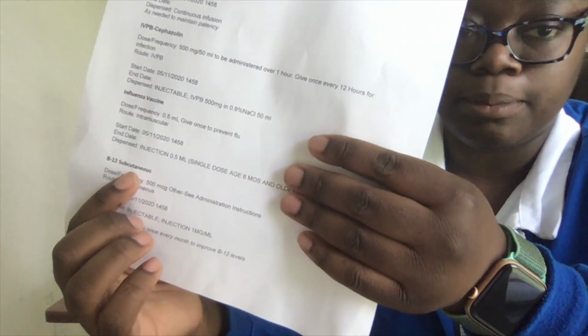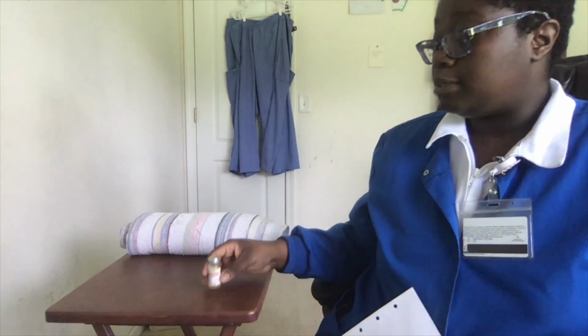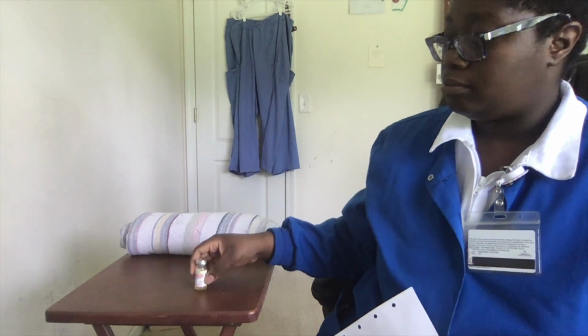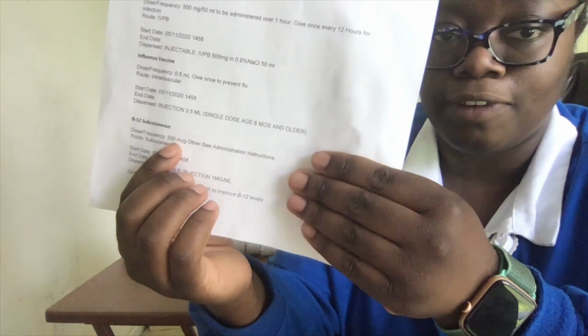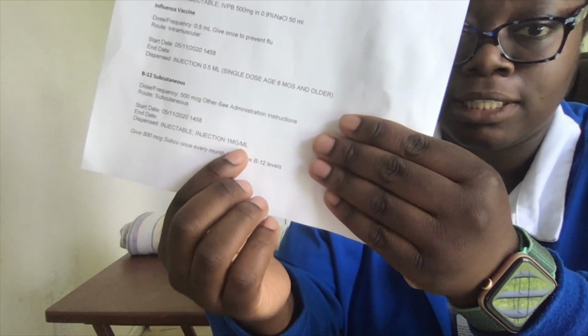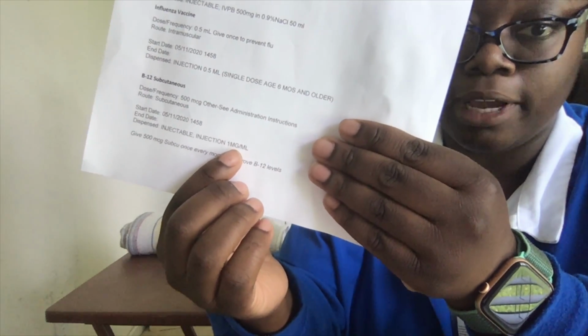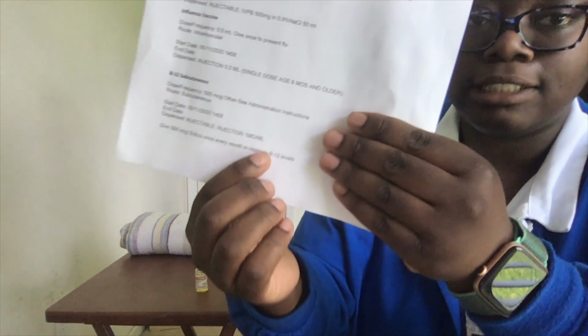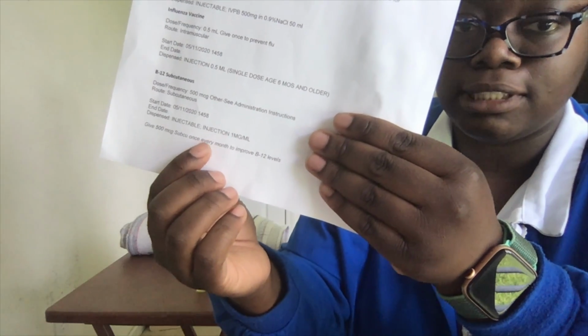This needs to be given subcutaneously, which is possible because this is a cyanocobalamin vial. There is going to be some math involved because the doctor wants 500 micrograms given to Anna, but this vial has 1 milligram per milliliter of fluid. And lastly, the doctor wants this given once a month, and the time has come for Anna to receive her next shot.